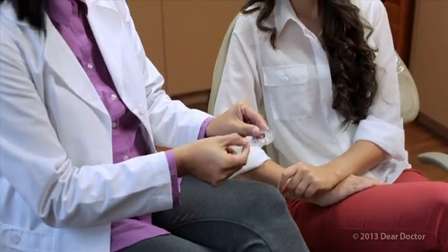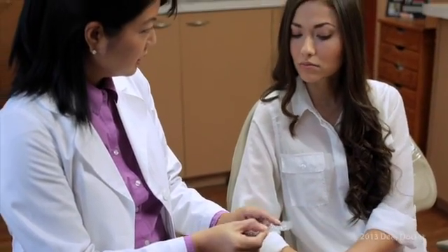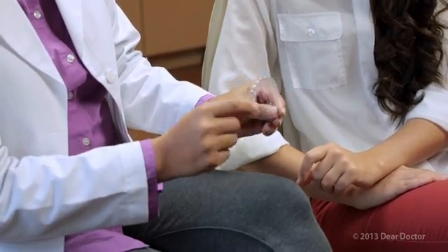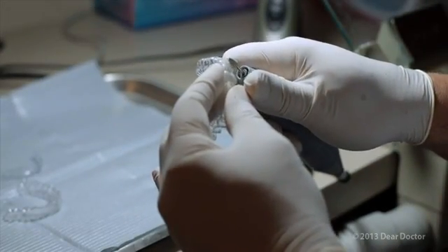Here's how it works. The first step is for your dentist to evaluate whether clear aligners are right for you. If they are, x-rays and impressions are taken, and an individualized plan designed by your dentist is sent to a specialized lab. They will make the trays that will gradually move your teeth into proper position.